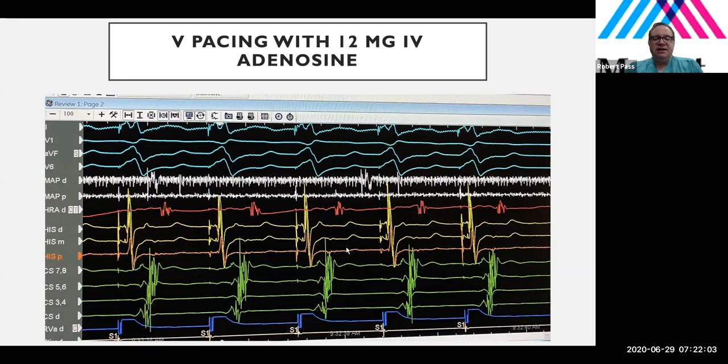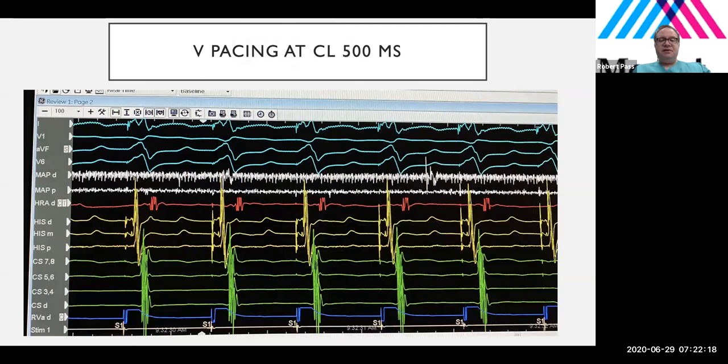The pathway is much farther from the pacing catheter tip in the right ventricular apex than the AV node. So when we're pacing the right ventricle, we go up the AV node because it conducts rapidly and because it is physically closer to the stimulus than the left-sided accessory pathway. In an older child, this is unusual, although not unheard of.